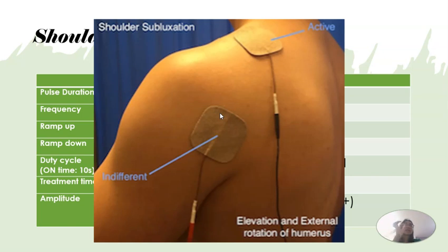Di ba kapag smaller ang electrode, mas increase ang current density. Okay? So, we kinda needed that with your posterior deltoid, kasi medyo mahirap siyang i-stimulate. So, para hindi natin kailangan ng masyadong mataas na milliamperes, okay, na amplitude, you could reduce the size of the electrode. No, if possible lang naman, if hindi, we can deal with equal size of electrodes for your supraspinatus and posterior deltoid.